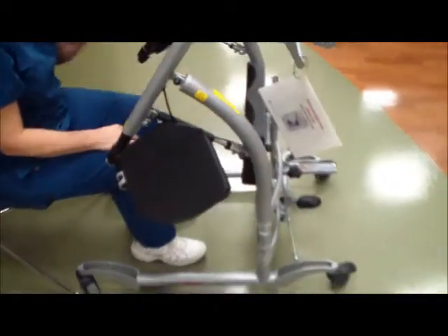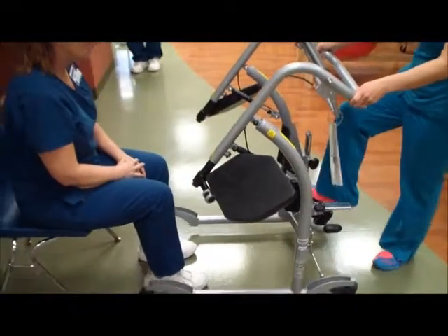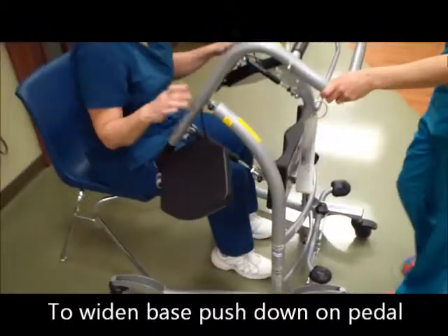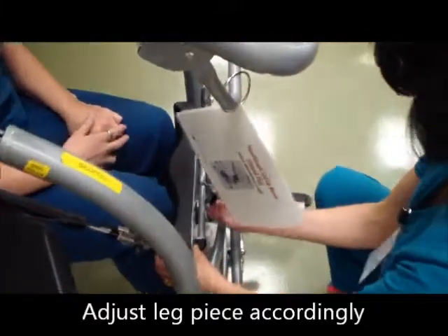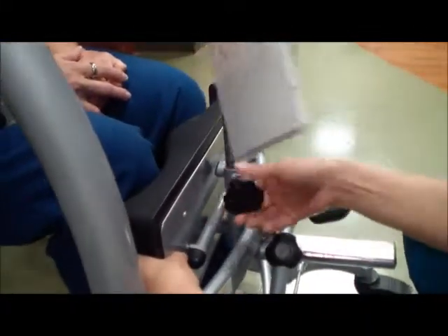So when you're trying to get it close to them, you may have to widen the front of it. Since this one won't come in, my chair's in the way. Get it around the wheelbase of the bed. So bringing it in, you can adjust the piece in the front, so it's at their shins. That's as low as that one goes.